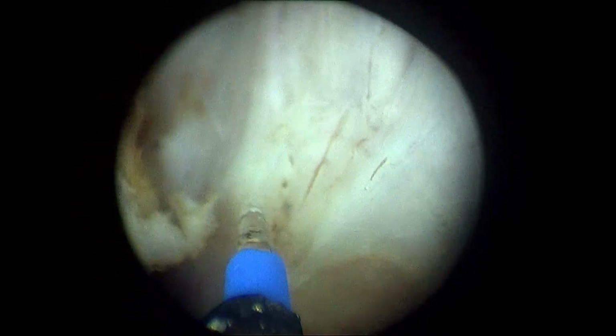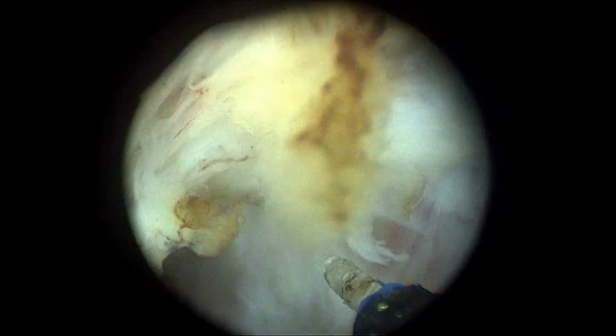So one can see that these are all the capsular fibers. Yes, sir, we can see very clearly.